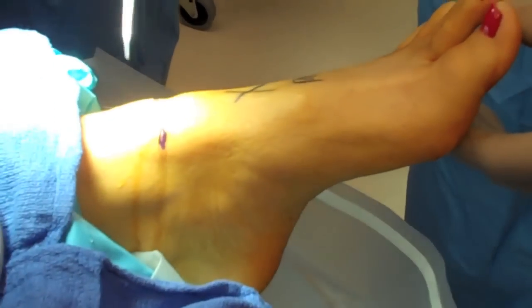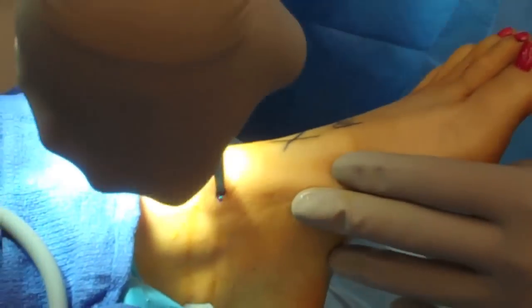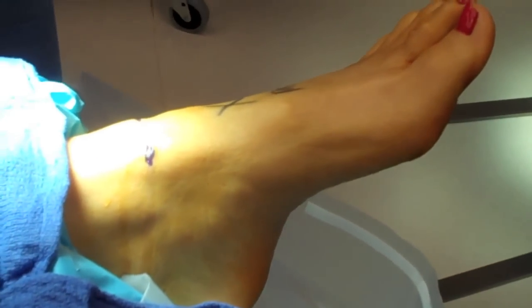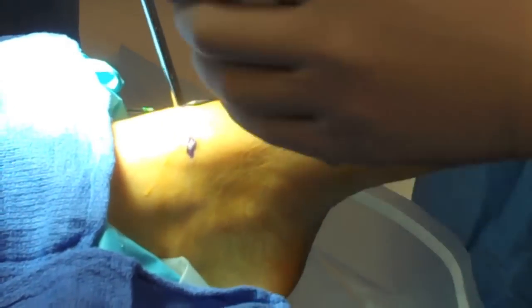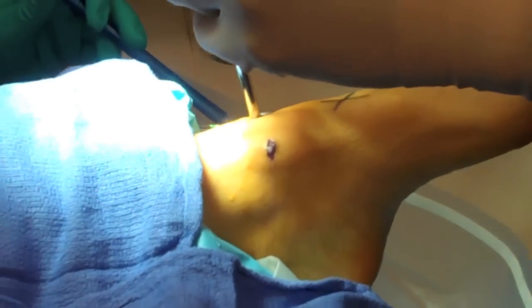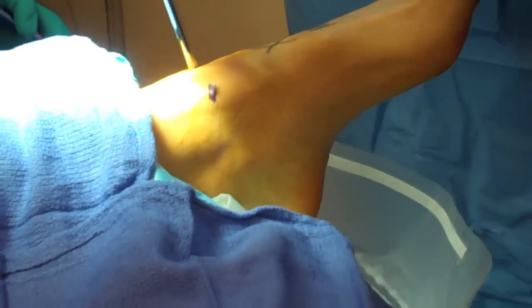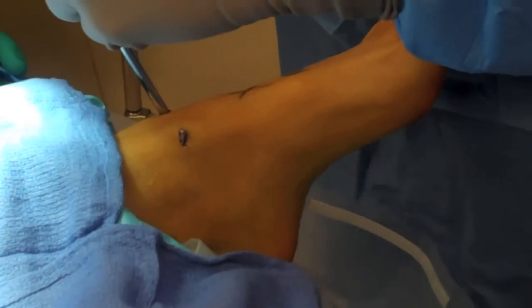Blunt dissection is utilized to reach the ankle joint capsule with a hemostat for both portals. A blunt tipped obturator is then placed in through the central portal. I utilize a 4.0 scope. A twisting type motion is utilized until you feel the articular surfaces. With the obturator being blunt, you will protect the articular surfaces and not damage them. I tend to direct the cannula slightly medially, anterior medially.